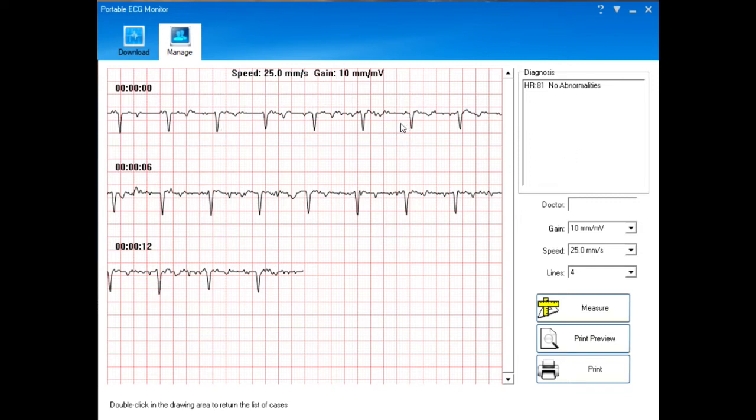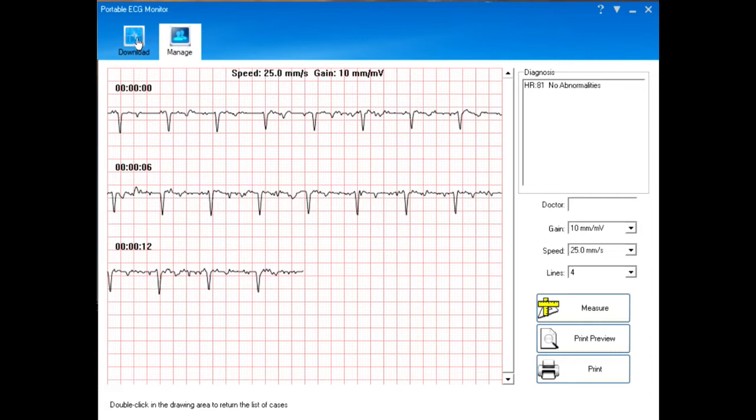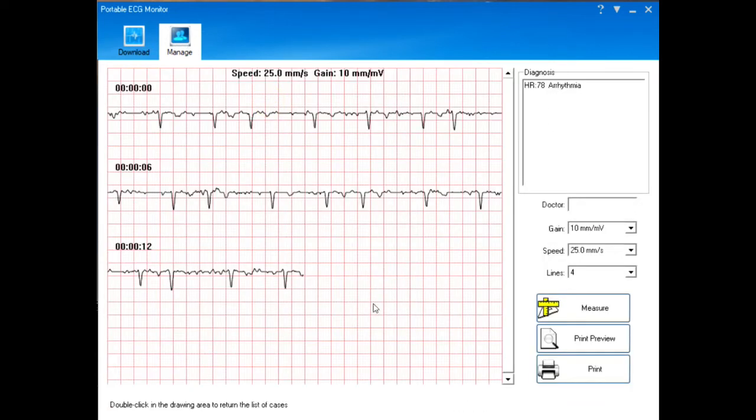That's a pretty good ECG, and if I was like that all the time my life would be more wonderful. Now let's have a look at the one I did previously — this is the rather poor one I took when I was feeling less than well. As you can see it's somewhat irregular, and when my heart is like this I feel less than well.